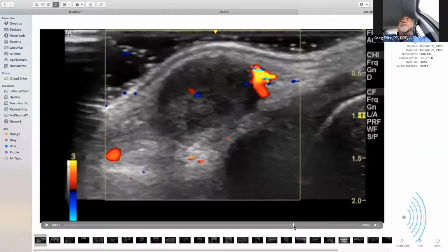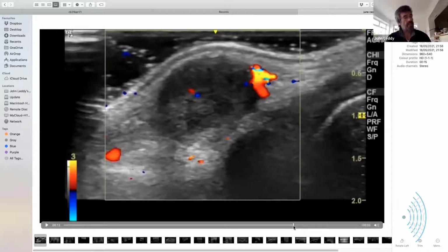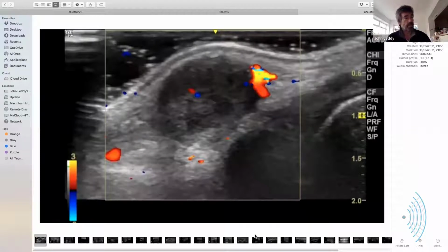Pulse repetition frequency is how frequent it sends out its carrier wave to determine whether there's a different phase in what the frequency is that returns, and it's 3 times a second? Yeah, 3 centimeters per second is the way they measure it. I can't quite remember how the calculations work, but basically it makes it very sensitive to low flow, but rubbish at depicting higher speeds, which just come out as a mess.